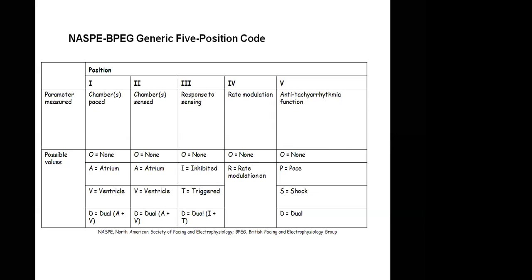That's one. When a patient is exposed to different electromagnetic waves, that's why, if a patient with an ICD is going for MRI, you have to reprogram the machine. Or if a patient with a pacemaker is going for an MRI, you reprogram the machine, right? Because there are MRI compatible pacemakers. Normally you do not take a patient that has a pacemaker to an MRI, because the MRI machine will magnetize the battery. But there are some MRI compatible pacemakers. Even at that, the MRI electrical waves can disorient the lead, so that the lead thinks the patient is having intrinsic activity, it will inhibit pacing, and the patient can just go into asystole.